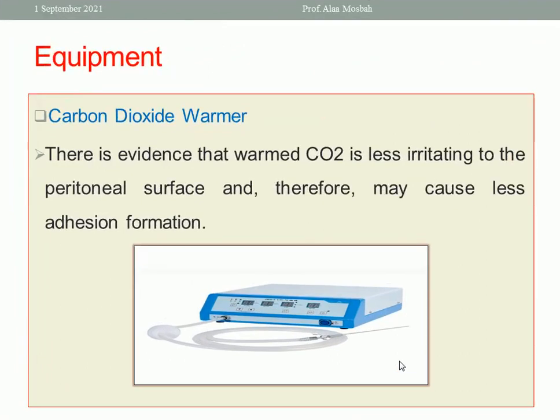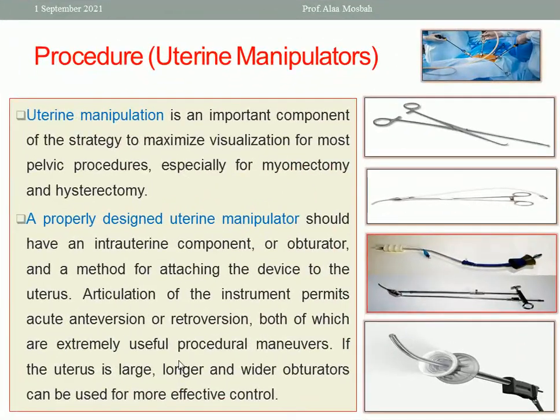Carbon dioxide warmer is like this one. There is evidence that warmed CO2 is less irritating to the peritoneal surface and therefore may cause less adhesion formation. So warming CO2 is better to decrease post-operative adhesions.